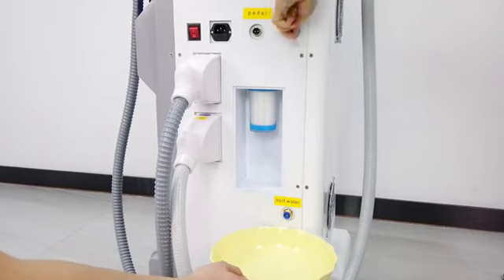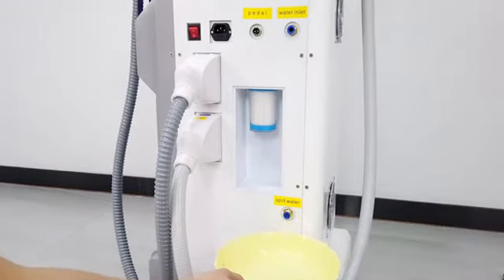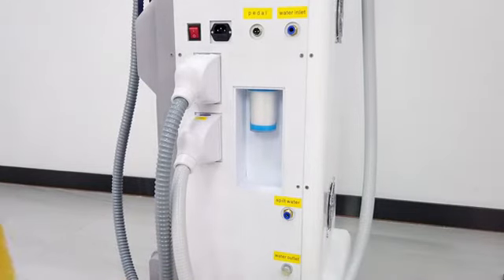And press the button. About the water outlet, normally we need to change the water every month. When we want to change the water, we need to open it and let the water out from the machine, and then add the water again.